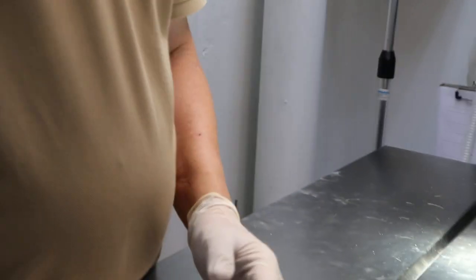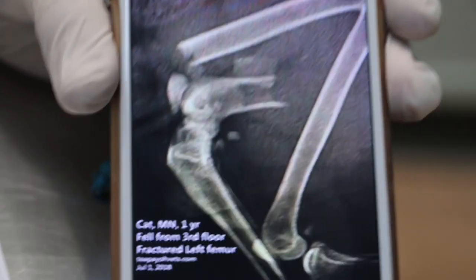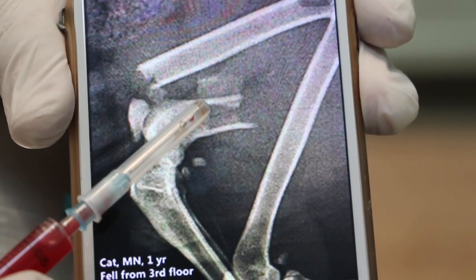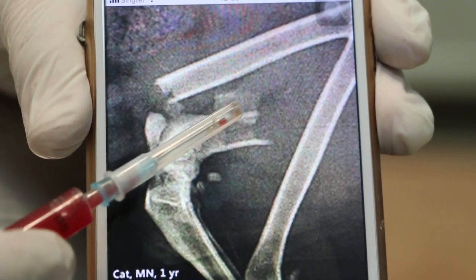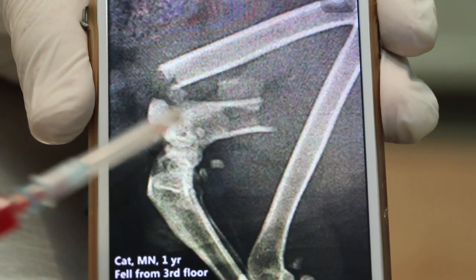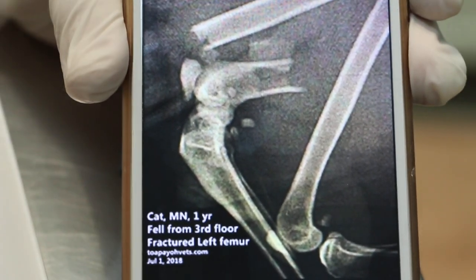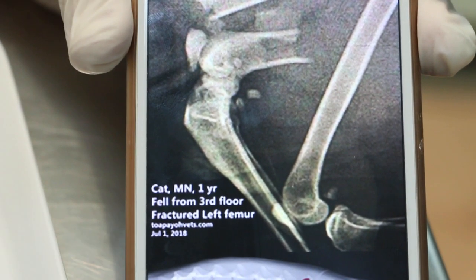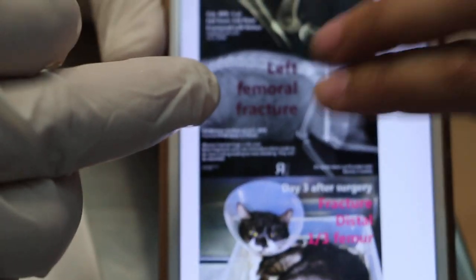Let me show the x-ray of what happened. 17 days ago the cat jumped down from three stories. You can see the left femur — the thigh bone — fractured in several pieces: one, two. This is the patella. So there was no choice but to do the pinning.